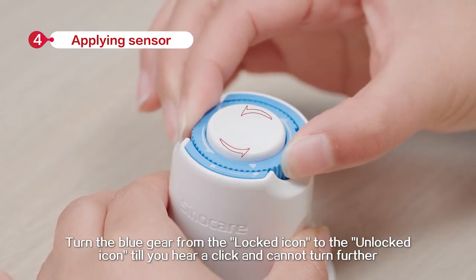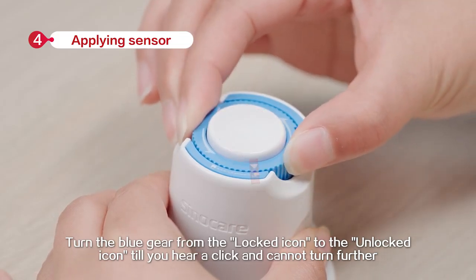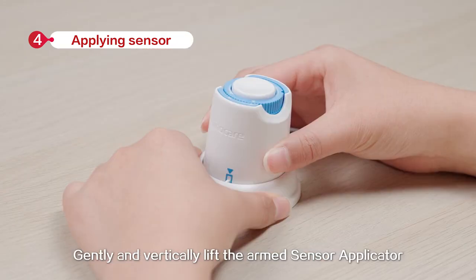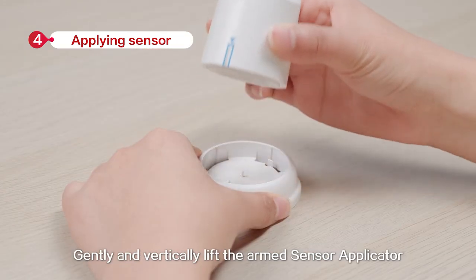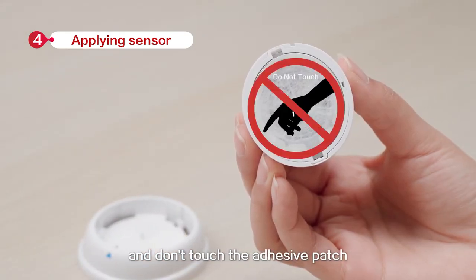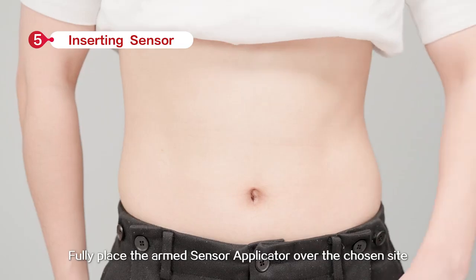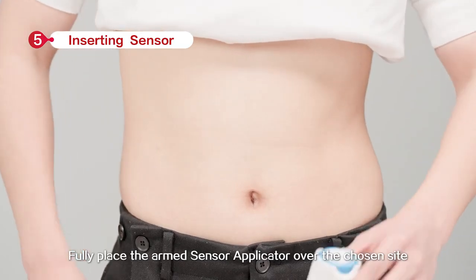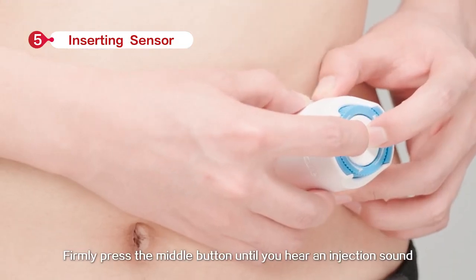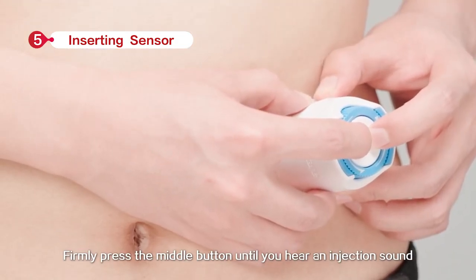Firmly press the sensor applicator down into the tray until you hear a click and it comes to a stop. Turn the blue gear from the locked icon to the unlocked icon until you hear a click and cannot turn further. Do not push down the middle button once the safety switch is fully released. Gently and vertically lift the armed sensor applicator and don't touch the adhesive patch. Fully place the armed sensor applicator over the chosen site. Firmly press the middle button until you hear an ejection sound.